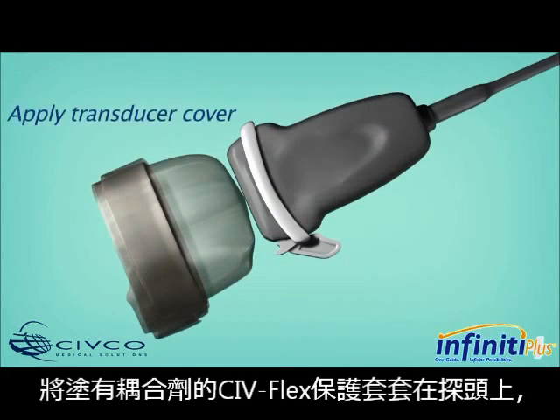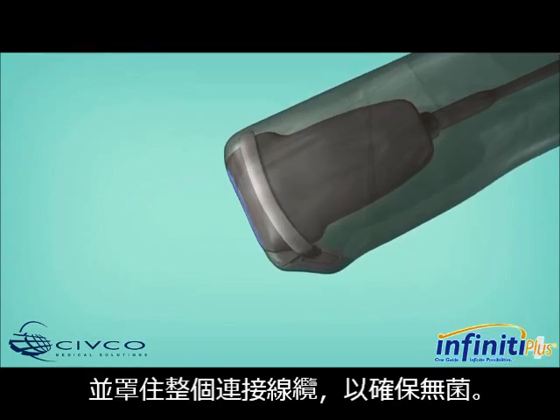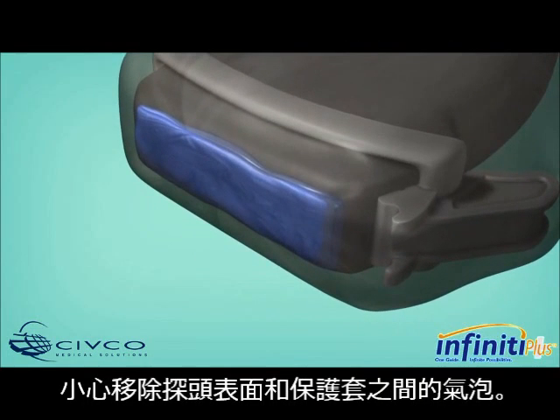Place the gelled CIV-Flex cover over the array of the transducer and extend the cover down over the length of the cord, ensuring sterile technique. Carefully remove any air bubbles that appear between the transducer face and the cover.